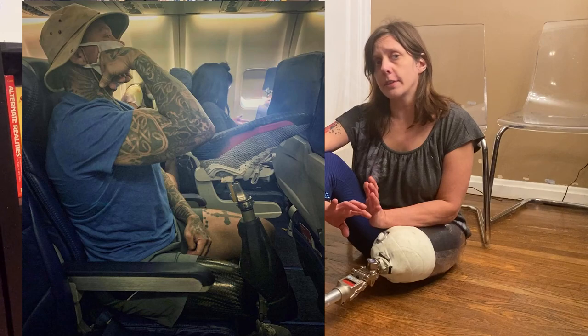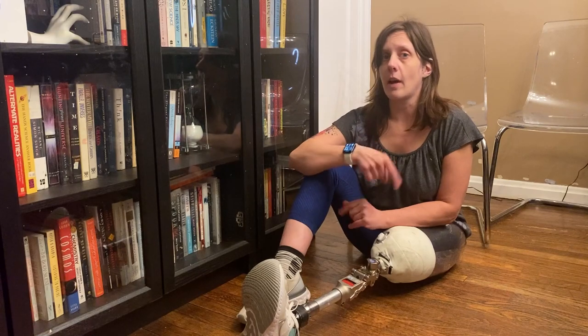So if you're into looking at prosthetics and how they work, you may have seen some amputees doing something really weird like flipping their leg around and wondered how the heck they do that. So here's how it's done.